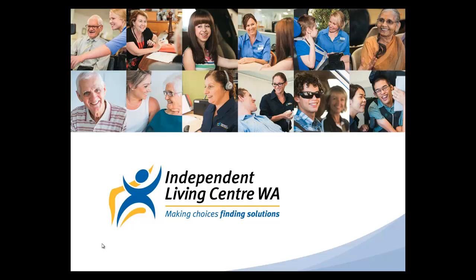This webinar is designed for teachers who are supporting students using Dynavox communication devices.